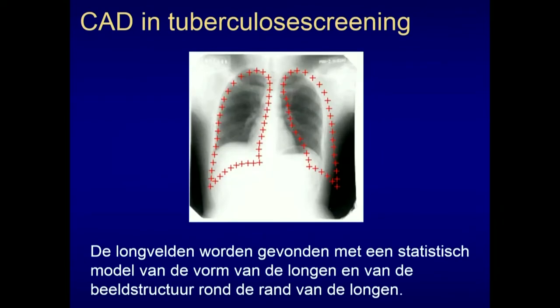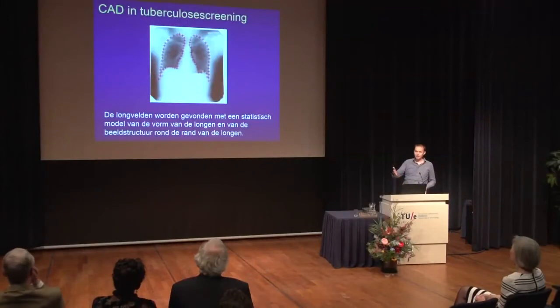And this is my lung field segmentation that I was very proud of. It was super advanced technology at the time. It's active shape models. These points automatically have learned what contour looks like, and then there's a global shape model. And Bart actually helped me. He outlined the lung fields in hundreds of images as a second observer in my study. I was also really happy that you did that. It was a lot of work.